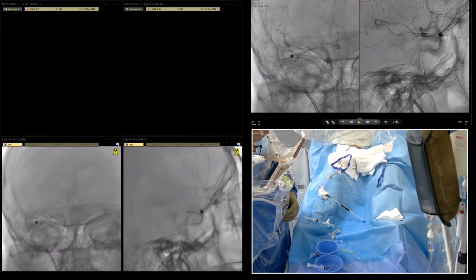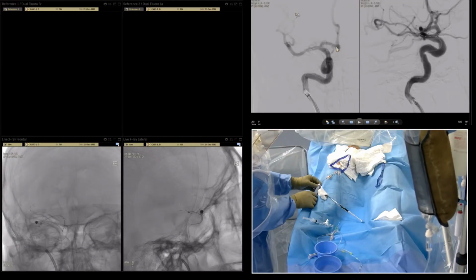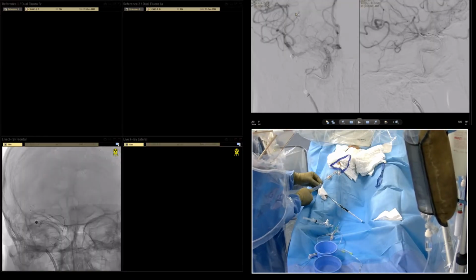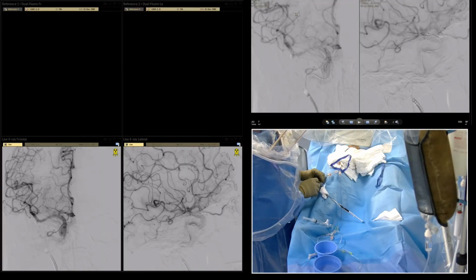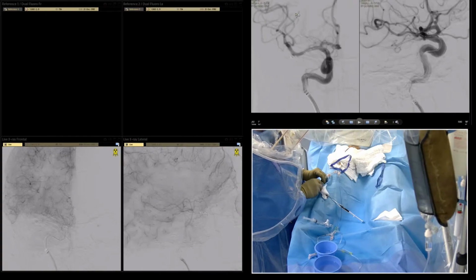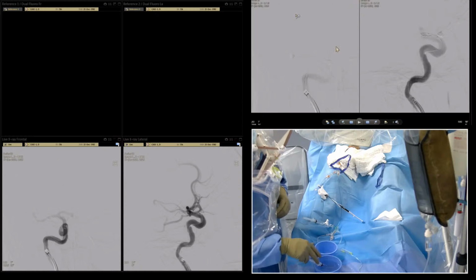It's good news. The bad news, we have a small piece of liquid embolic in the opercular branch, but that territory is usually nicely covered with the collaterals. Huh?